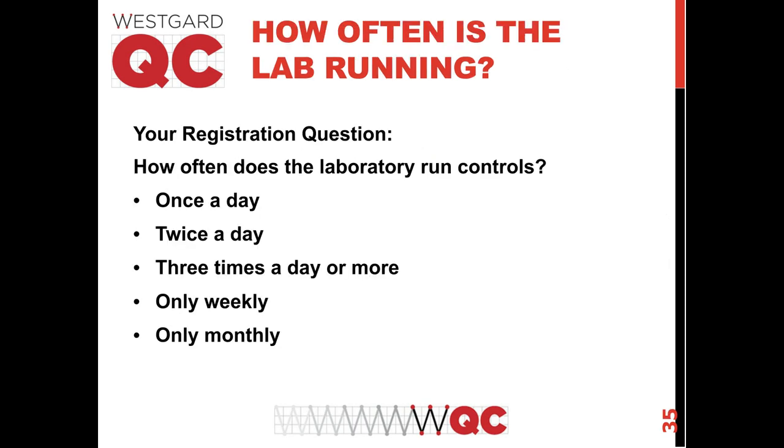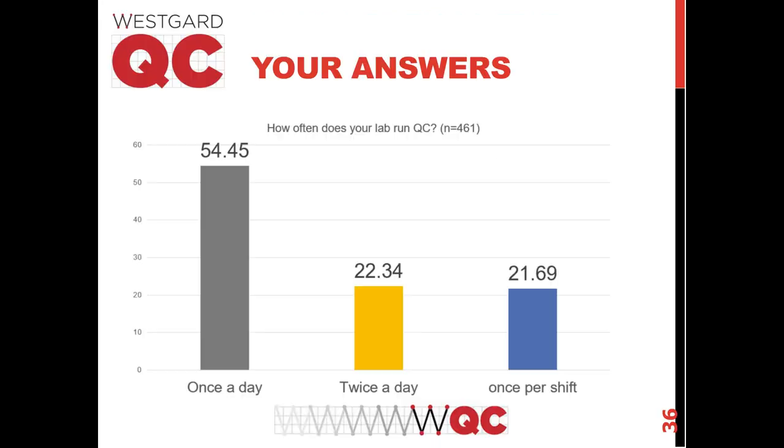And this brings us back to our registration question. We asked you this as you signed up for this webinar, and we saw that about half of you run QC just once a day, a little under a quarter run it twice a day, and a little lesser than that is running once per shift, which could be 2 or 3 times a day. It really depends on the operational schedule of the laboratory. So again, that's the conventional response, running once a day.